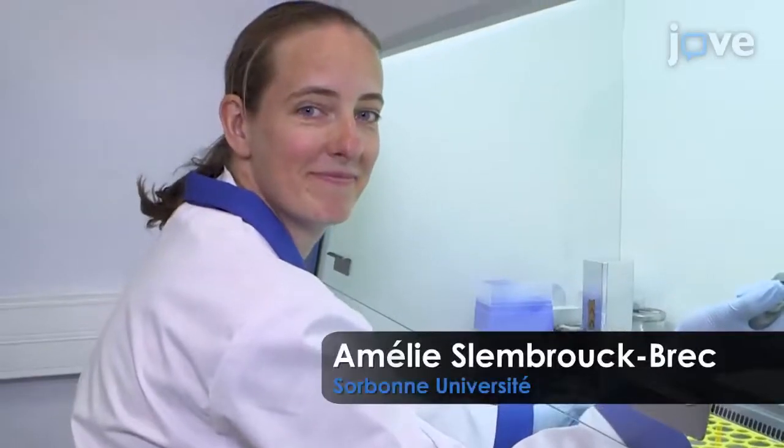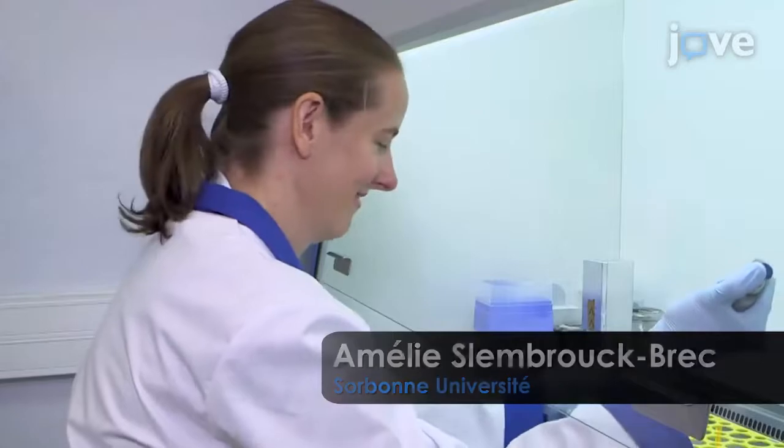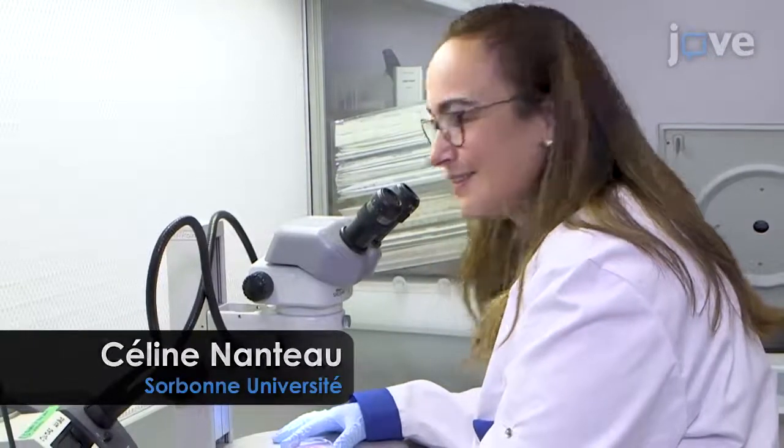Laboratory engineer Amélie Slembrouck-Brec will be demonstrating the method to generate and isolate retinal organoids, and laboratory engineer Céline Nanteau will be demonstrating the strategy for retinal pigmented epithelial or RPE cell production.